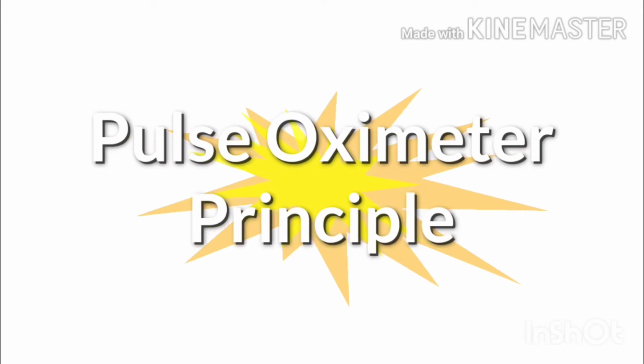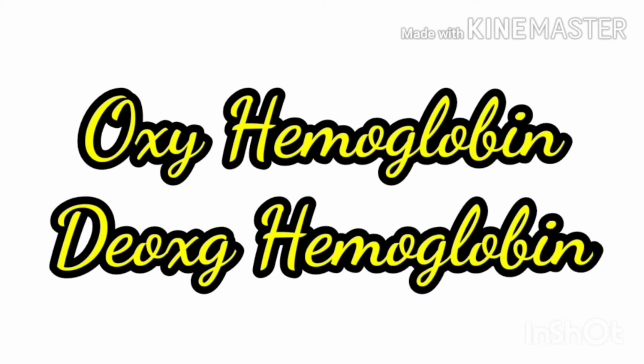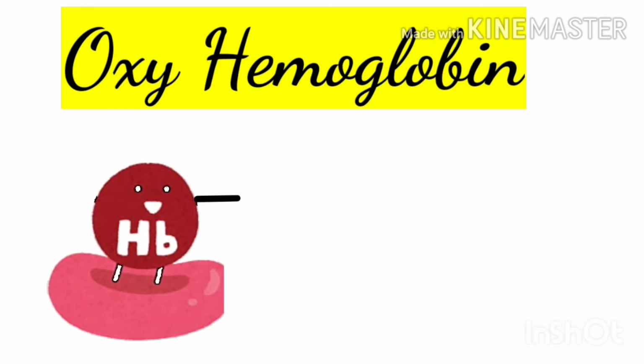To understand the principle, we should know two terminologies, that is oxyhemoglobin and deoxyhemoglobin. What is oxyhemoglobin? Oxyhemoglobin is nothing but the hemoglobin which carries the oxygen.